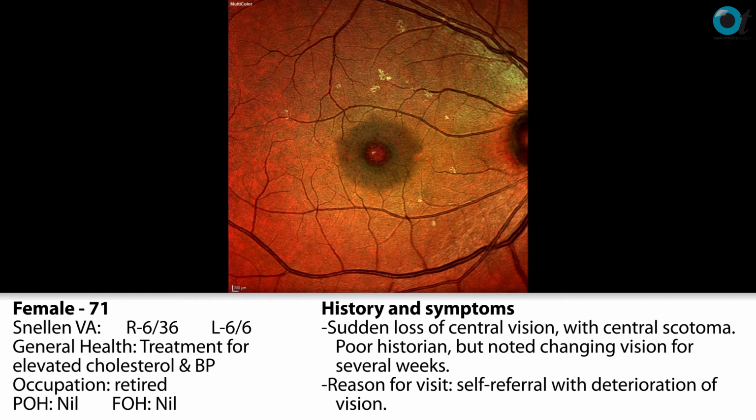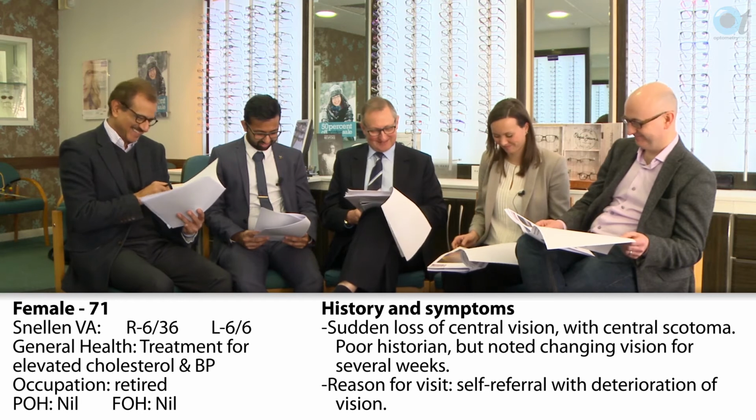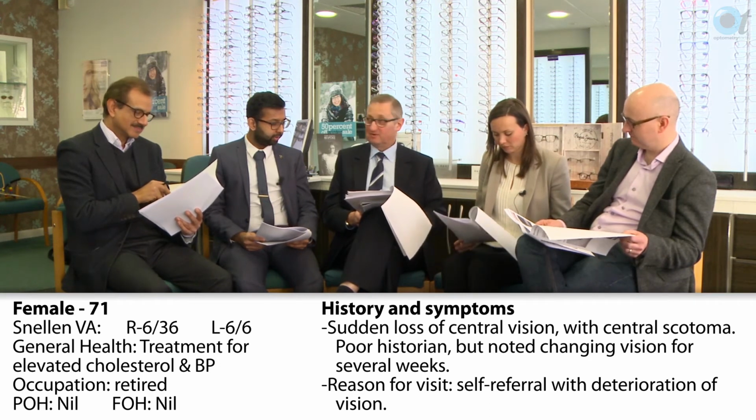To me, she looks the ideal candidate for a macular hole because female, over 60, sudden loss. She's got quite a few, look to me like drusen around in the macular region. From the fundus photo, it looks like a very classic macular hole. I feel she's almost out of a textbook, but I don't know the whole of that textbook, in case there's something else going on that I'm not sure about. Okay, so the fundus signs you think support the OCT signs and support Ian's view then?